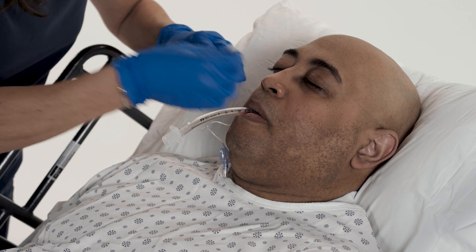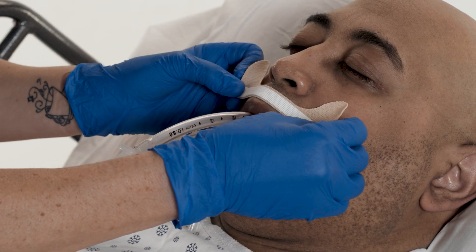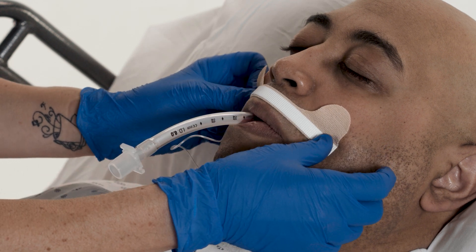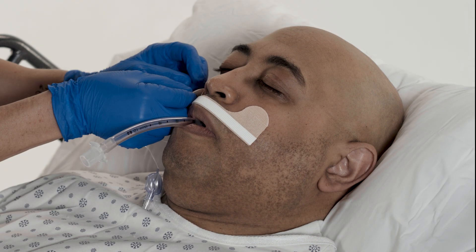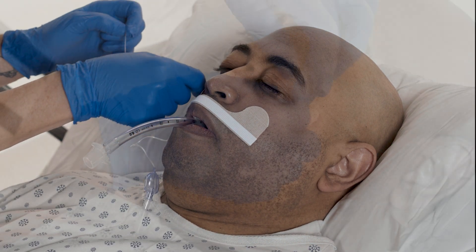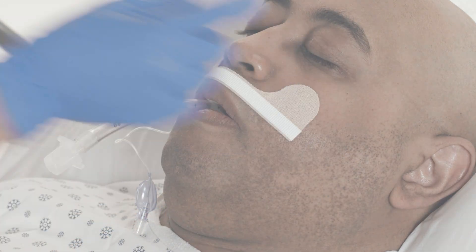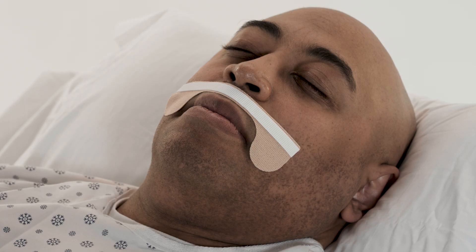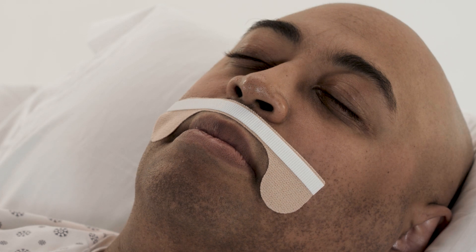Apply provided skin prep. With tabs up, apply the adhesive base above the upper lip. Remove the liners that are remaining on the base at each cheek. For patients with a small face or an injury on the cheeks, apply the base tabs down.